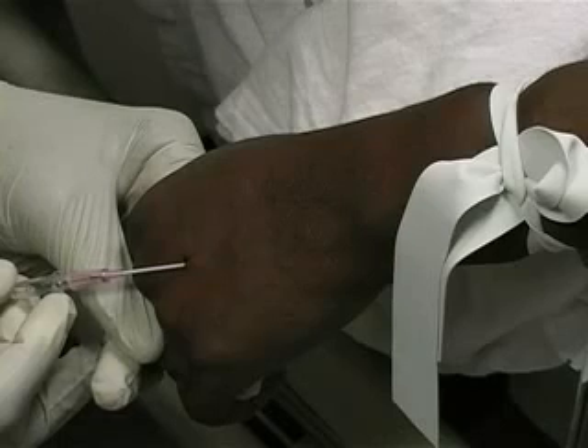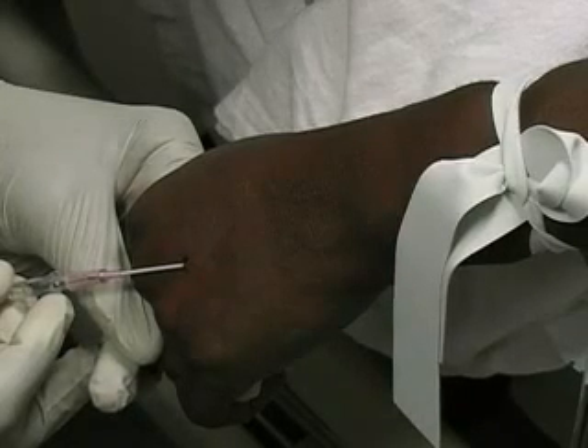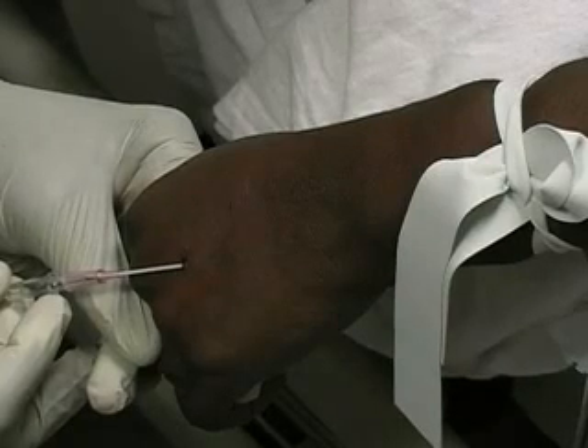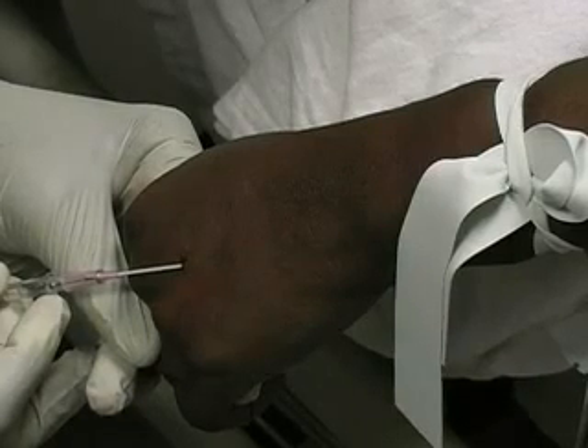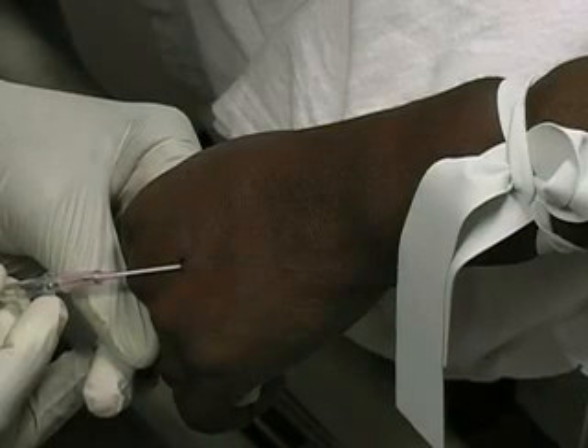Inserting an intravenous catheter is an essential procedure in a variety of clinical situations. Common reasons to place an IV include fluid replacement, medication or blood product administration, and to give diagnostic agents, such as contrast.